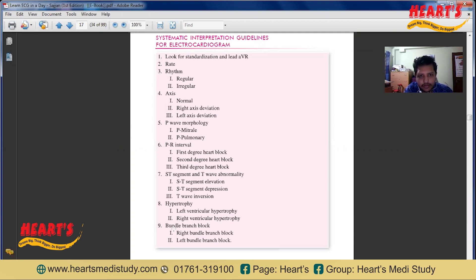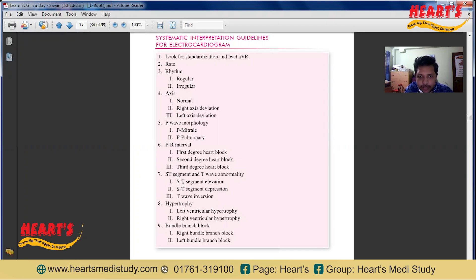There are some points we should remember for interpretation of any ECG. First, we should look for the standardization and the lead AVR. Then we should see the rate and the rhythm — whether it is regular or irregular. Then the axis, whether it is normal, right axis deviation, or left axis deviation. Then the P wave, whether there is any P mitrale or P pulmonale. Then the PR interval — whether there is any heart block: first degree, second degree, or third degree. Then the ST segment and T wave — whether there is any ST segment elevation, ST segment depression, or T wave inversion.